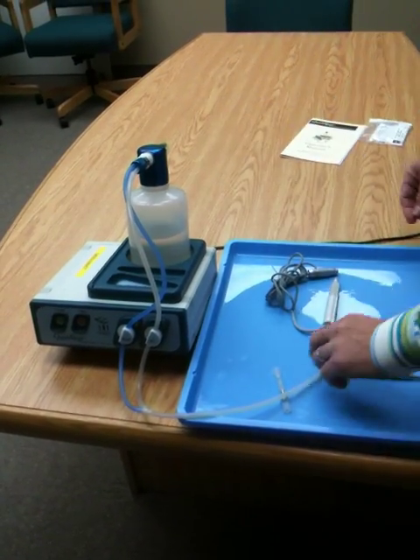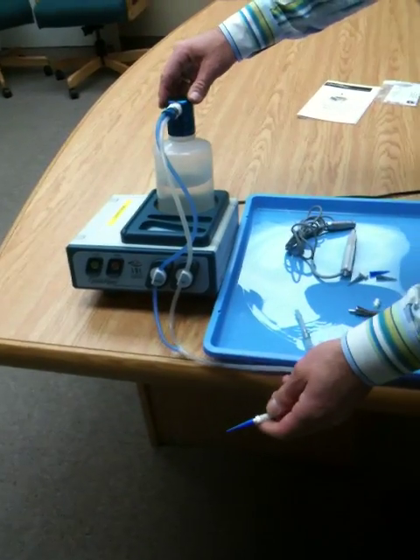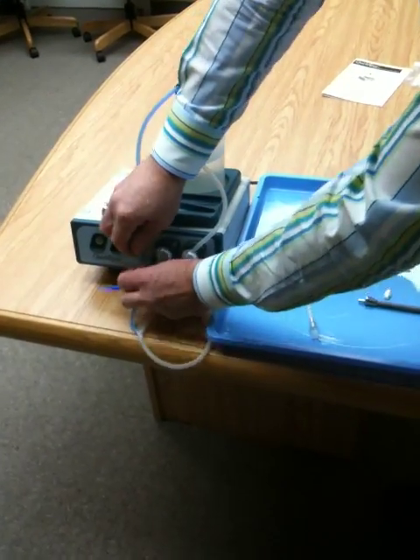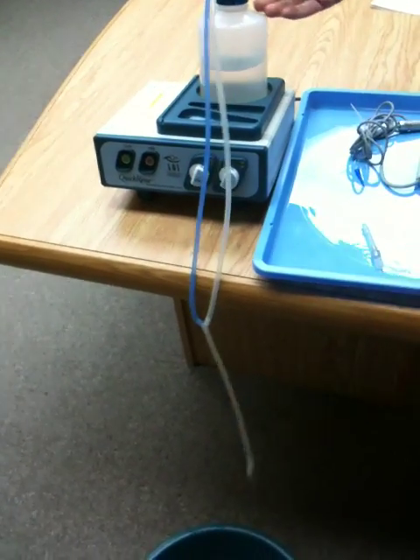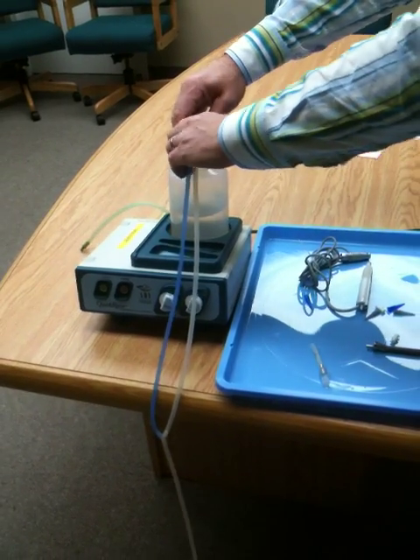When you're finished using the unit, turn it off. Bleed the pressure from the lines before you disconnect the quick disconnects. Otherwise, you're going to get fluid exploding out of the unit because of the pressure that's built up inside. So bleed your lines, then remove your tubing.